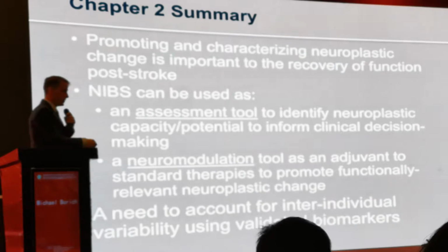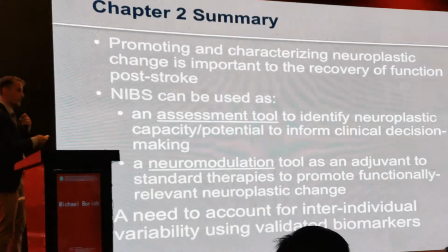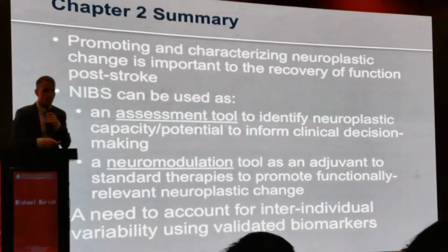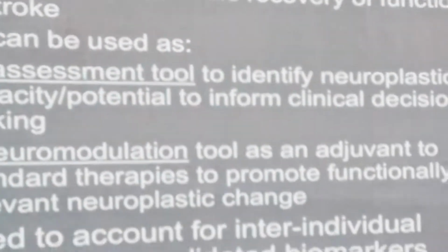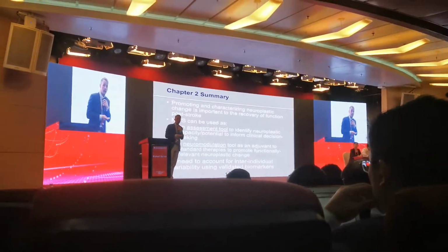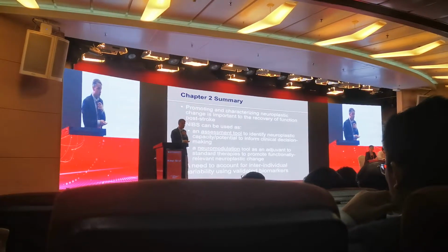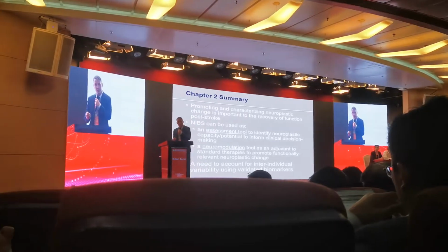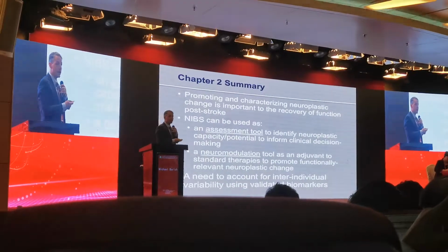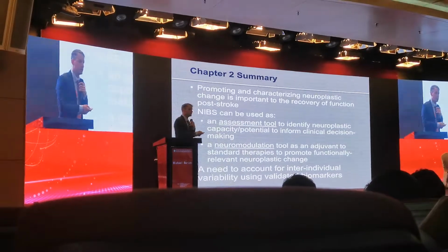Again, just to very briefly summarize, non-invasive brain stimulation, in this case, the only example I provided today was PASS, can be used as an assessment tool, but also as a neuromodulation tool. And I think the other very important piece that I'd like you to take away from the talk is that it's critical to individualize stimulation, to maximize the effect, and to increase the numbers of responders to the individual stimulation effects. And perhaps we can actually use TMS and other perturbation imaging approaches to identify those likely responders. Right? Because it's probably the case that not everyone will respond to non-invasive brain stimulation. So we want to know who those individuals are that will respond.